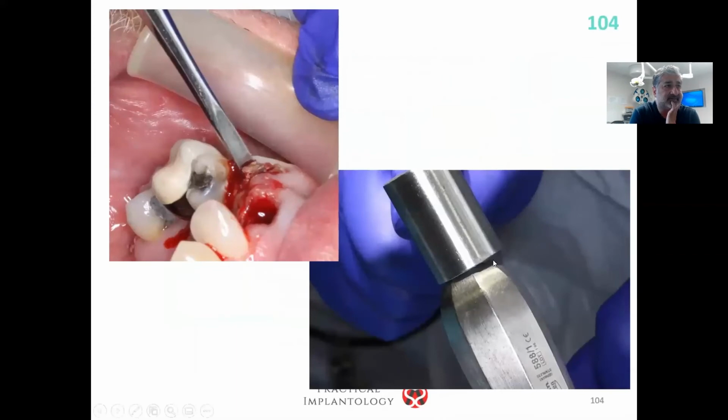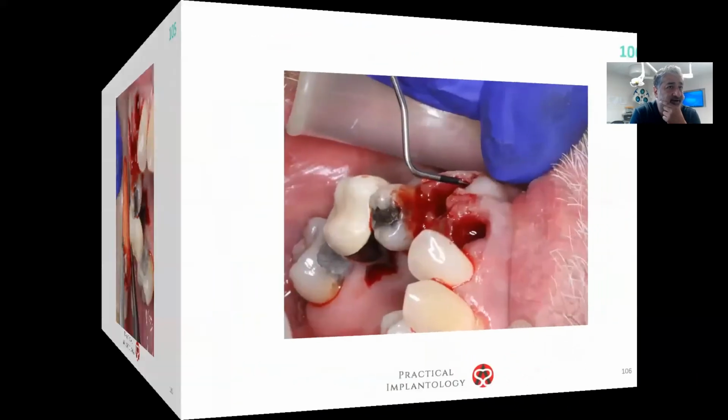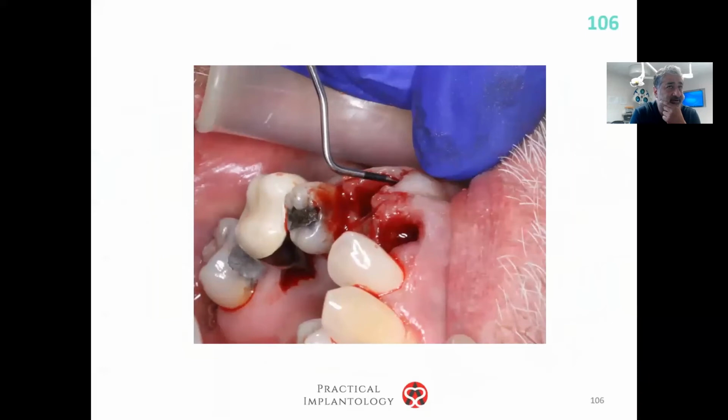And again, sometimes you go down the long axis, you're finding it very hard, especially on older patients, to get down that bone because it's quite brittle. Then I just sometimes use a tap down the long axis. It's just a gentle tap, and out came the next root. Invariably, about 80% of my teeth come out on their own, meaning I twist, I wait. I don't twist like that, I just twist about 20 degrees, 15 degrees, 10 to 15 degrees, and I wait.